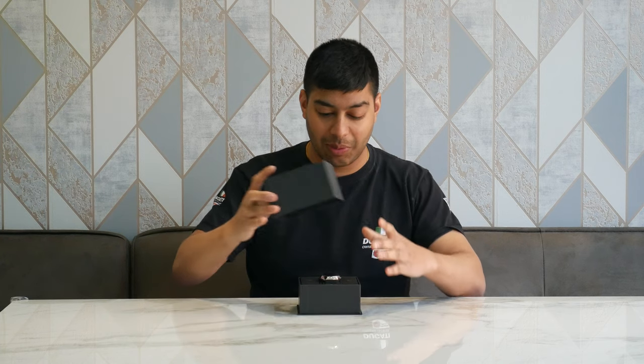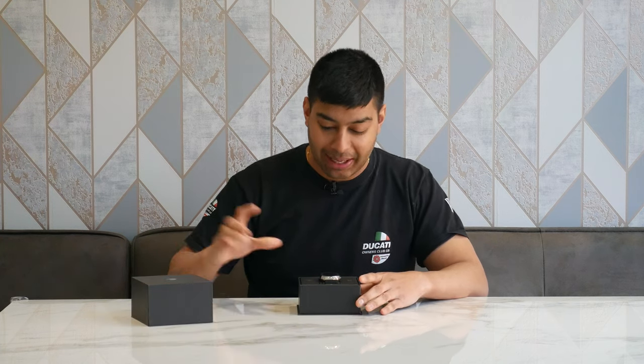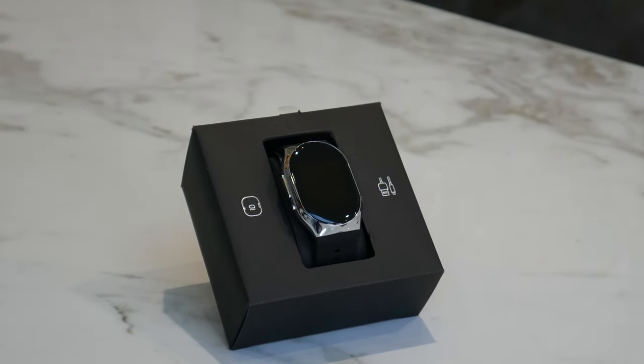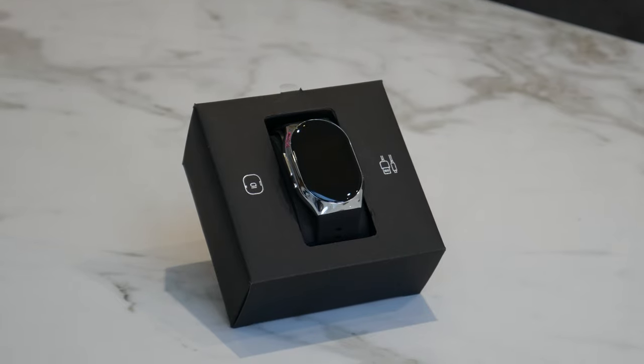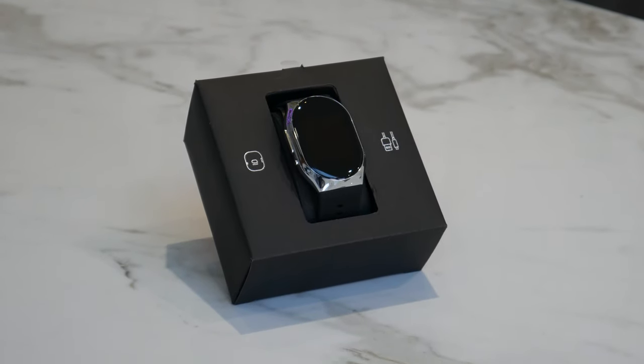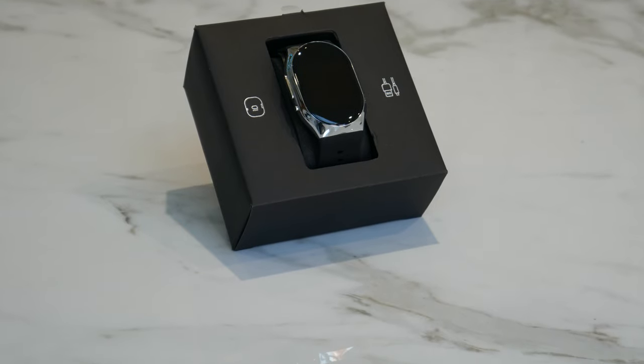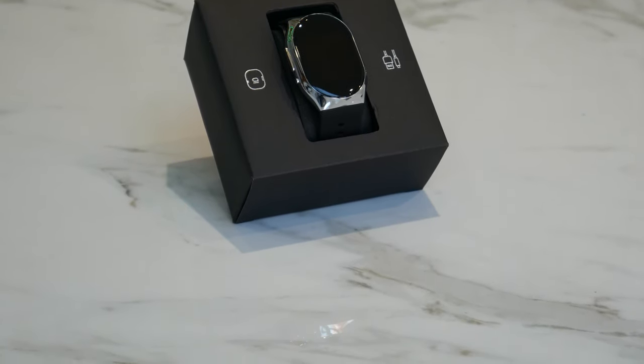This is the YHE BP Doctor Pro smartwatch. Let's see what we get in there. Nice black packaging — open it up, you've got the nice watch in there with a chrome bezel surround, a silicone wrist strap, and an LCD face on the front. I'm going to take this out and have a look at the accessories inside the box.